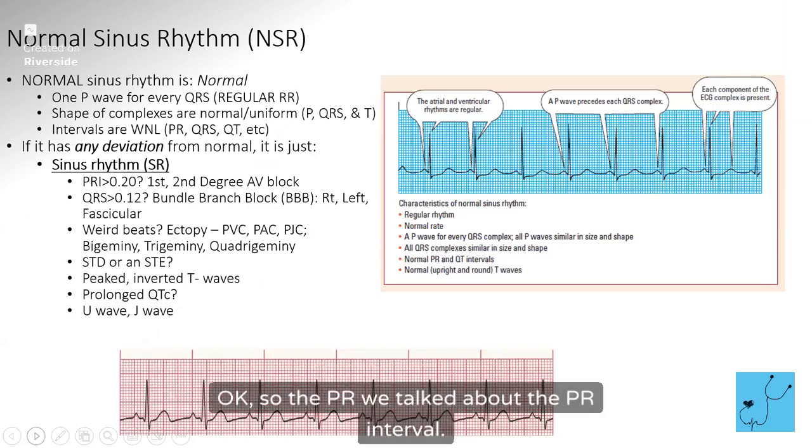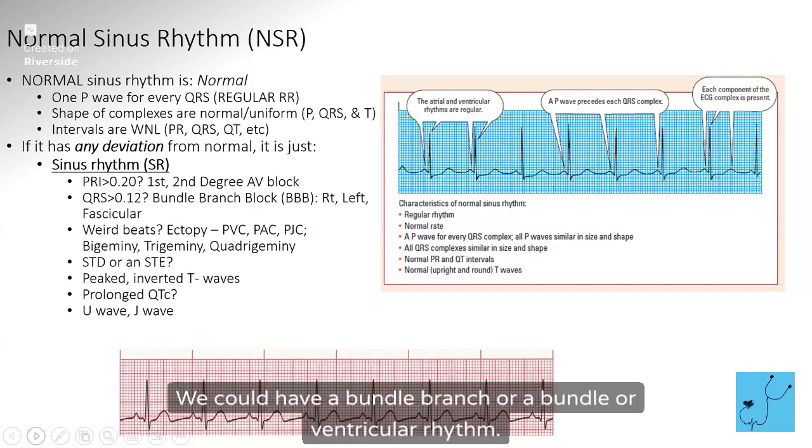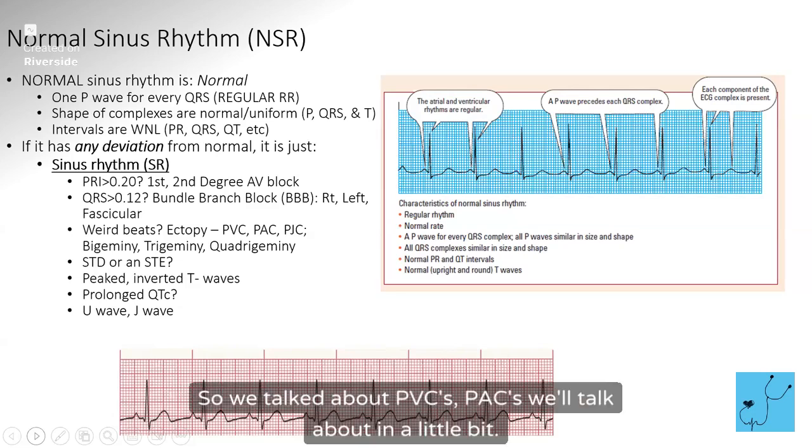Okay, so the PR, we talked about the PR interval. If it's greater than 0.2, we have an AV block. QRS greater than 0.12, we could have a bundle branch block, or a ventricular rhythm, any kind of weird beats. So we talked about PVCs, PACs, we'll talk about in a little bit.